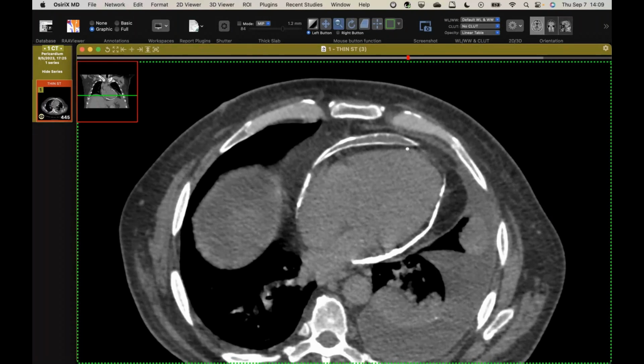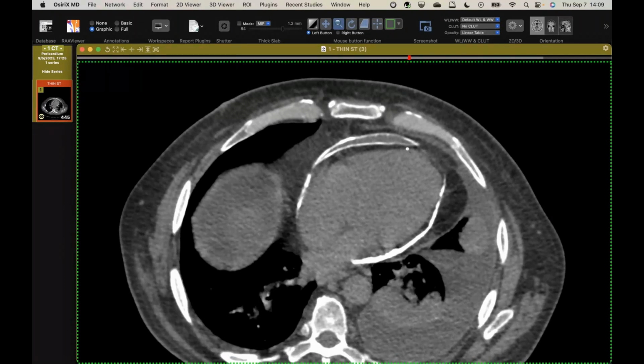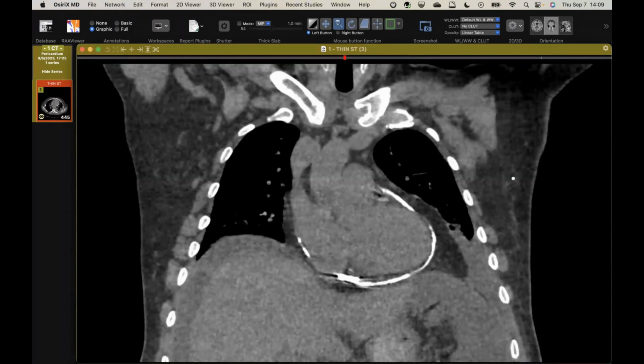No risk factors for TB, no known connective tissue disease. So the thought is it may be from a previous episode of viral pericarditis. Patient had a flu-like illness a while back, but that's the only thing that anyone's been able to work out. I don't know if you've ever seen anything this extensive calcification wise. Yeah, that's exuberant. Pretty nice.